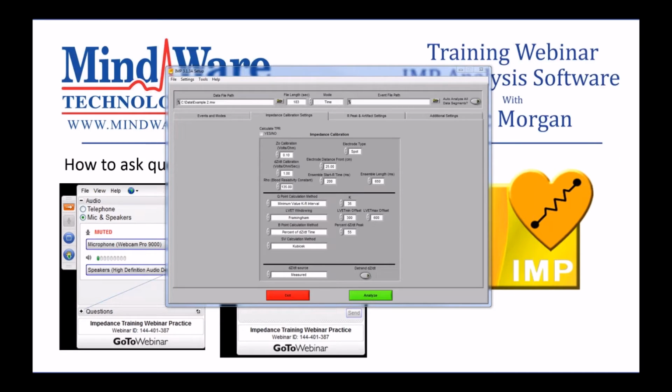Okay, we've got another question regarding the difference between impedance and HRV editing. This is a pretty complex topic, and it's difficult to answer quickly. But we do have a blog post on the subject that I will show you.